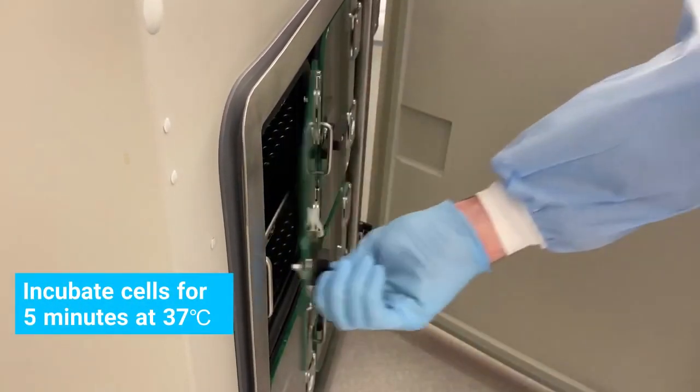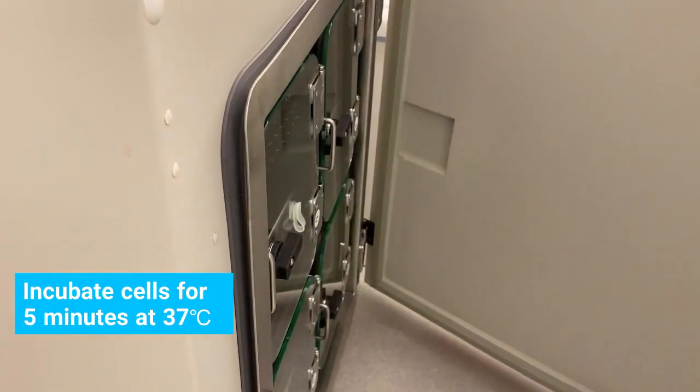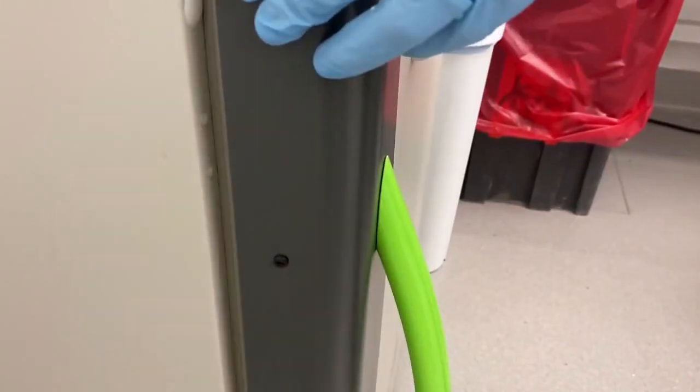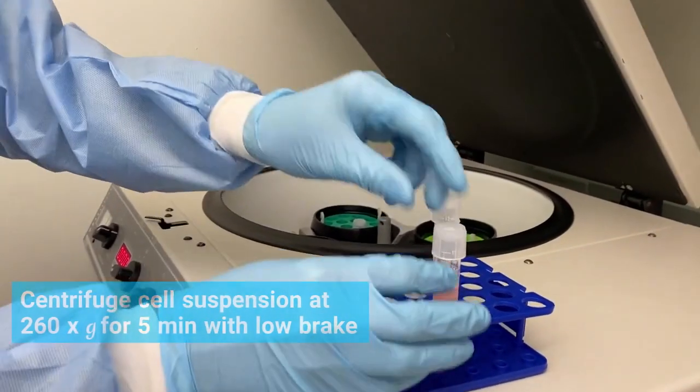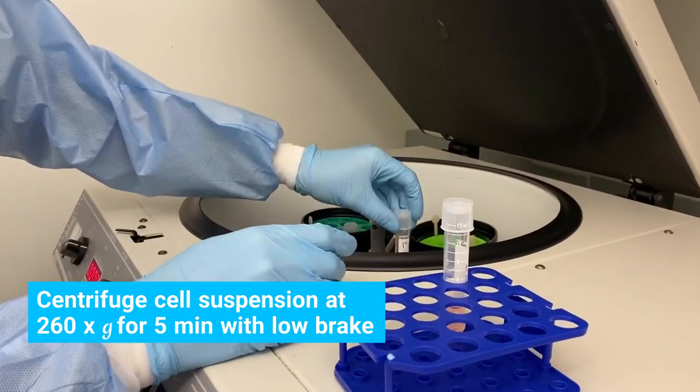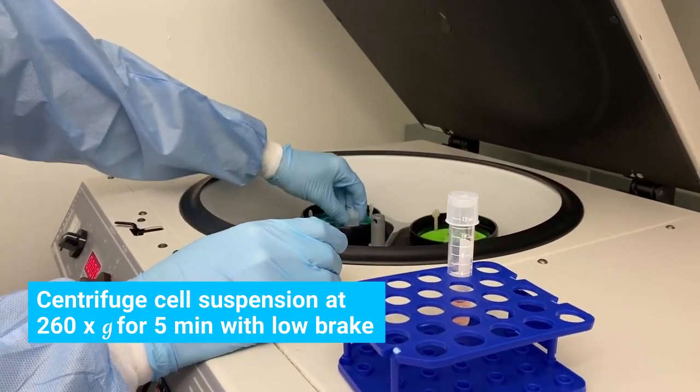Incubate the cells for 5 minutes at 37 degrees Celsius. Centrifuge the cell suspension at 260 times G at room temperature for 5 minutes with low brake.